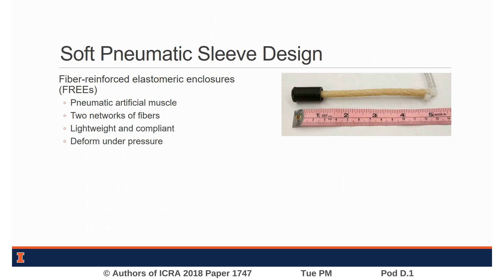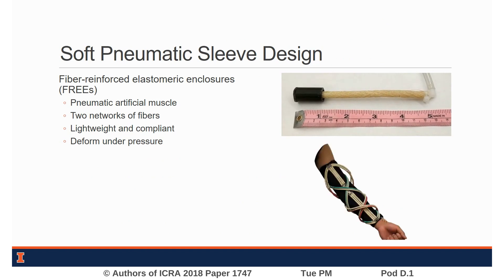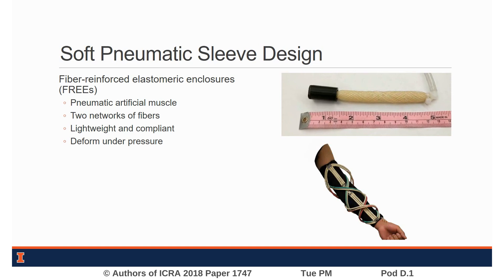Soft robotic actuators are well suited for use in exoskeleton applications due to their innate compliance and low weight. We have developed a wearable soft robotic sleeve that uses fiber reinforced elastomeric enclosures, or FREEs, to provide actuation and stiffness at the elbow for augmented lifting and carrying.